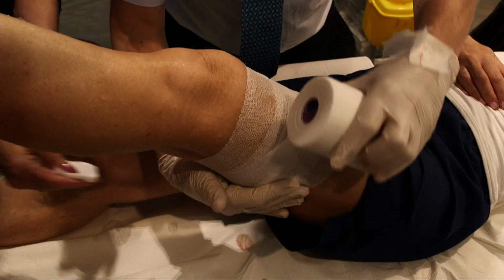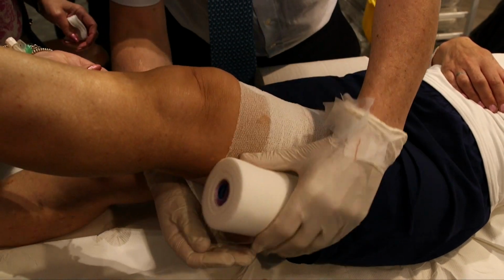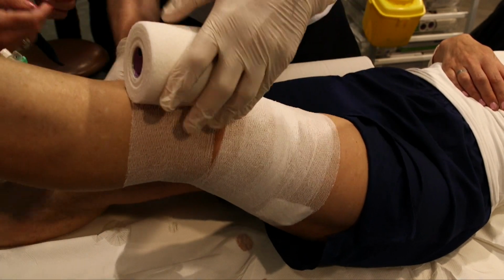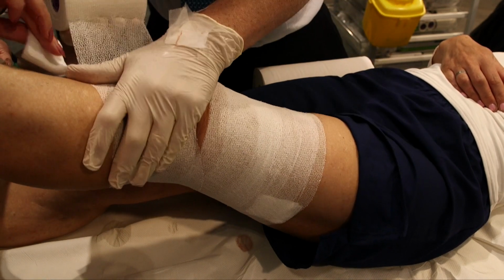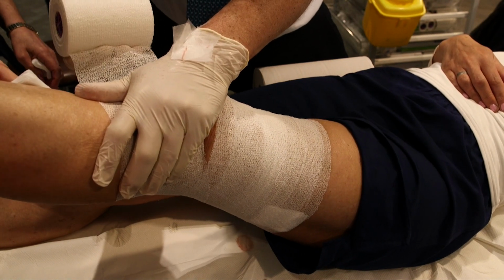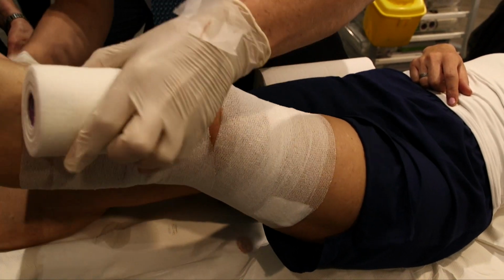Well, this stuff, as you know, has got a pretty hard end point, but I don't actually put it on at full stretch, unless I want the patient's leg to drop off. So it hasn't got much elasticity. So there it is, slack, and when I pull it, that's about as much stretch as you get. So it is fairly close to its elastic limit, I would say.